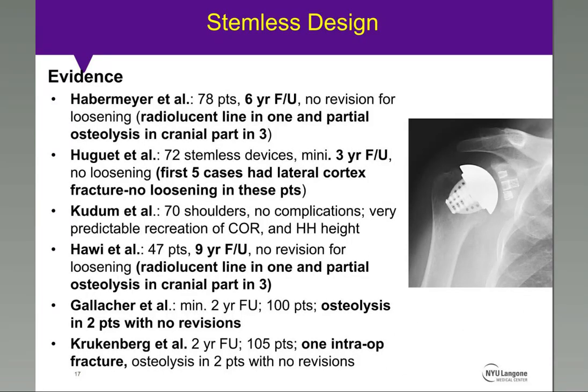The evidence is out there, but it is short and midterm, with the results comparable to the short and standard stems. The radiolucent lines around the fin and lateral cortex fractures that have been reported are legitimate concerns, but they have not been correlated to loosening at short or midterm follow-up. And we'll talk more about that in the subsequent slides.